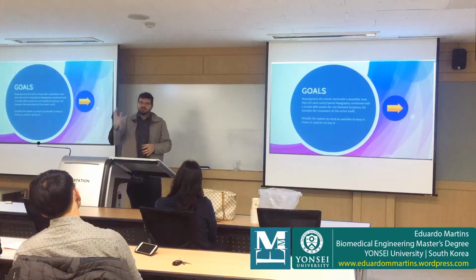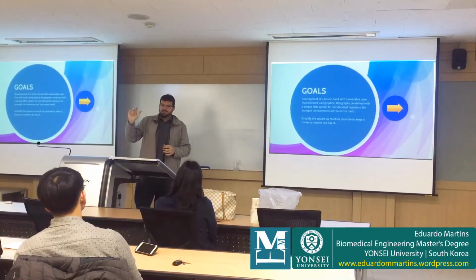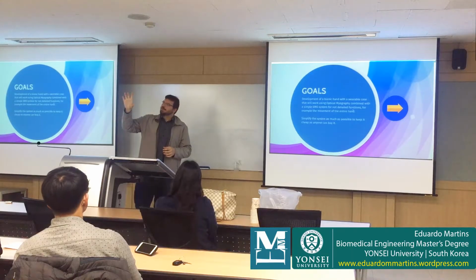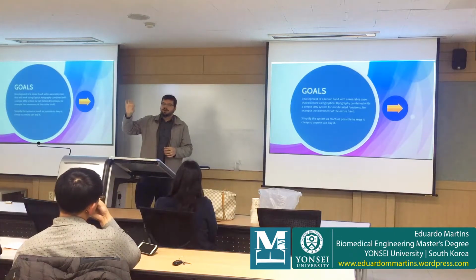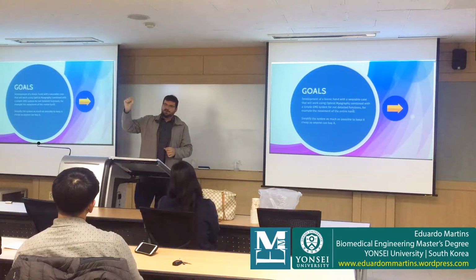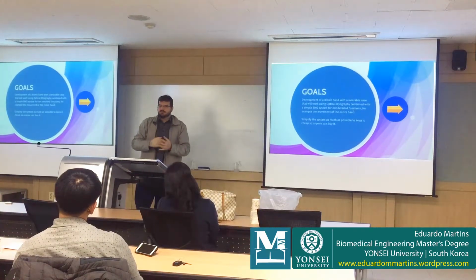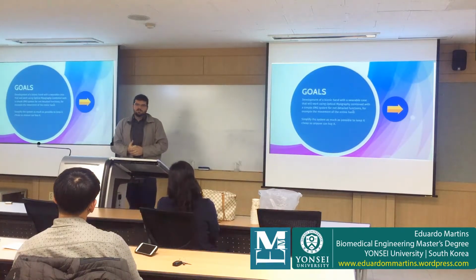So the main purpose of this project is to complement a bionic hand to have independent finger movements. For the entire hand, I can use this system too, but for pinch, maybe we need to use EMG, or for the entire hand. So we can combine these two technologies, just to complement the EMG, because it's not possible to get independent finger movements with EMG. So that's why I thought about this project.